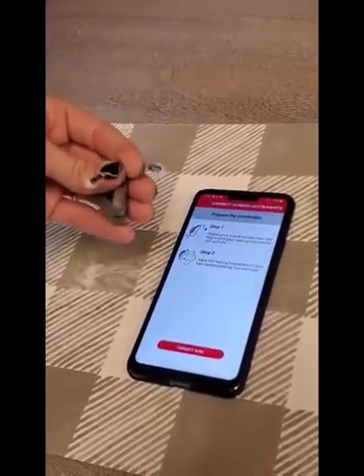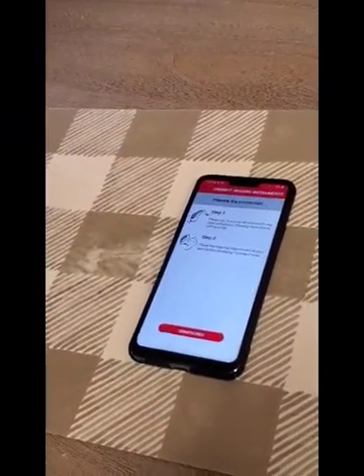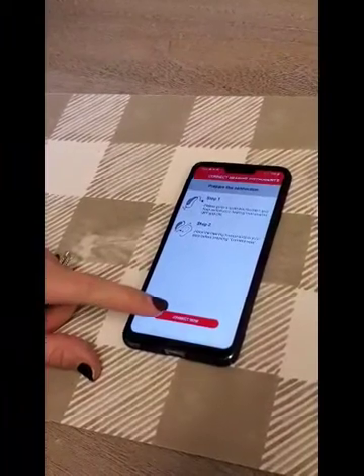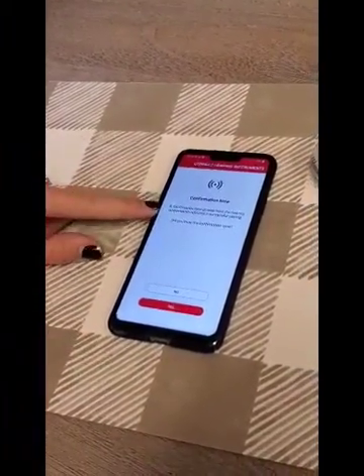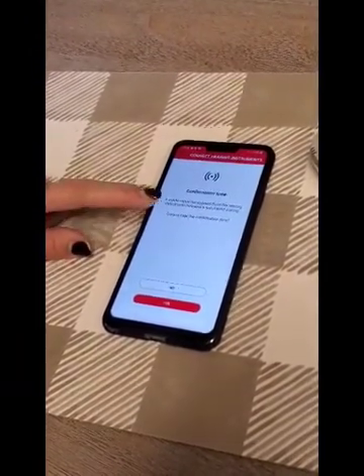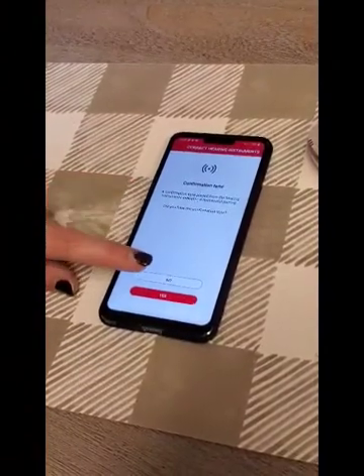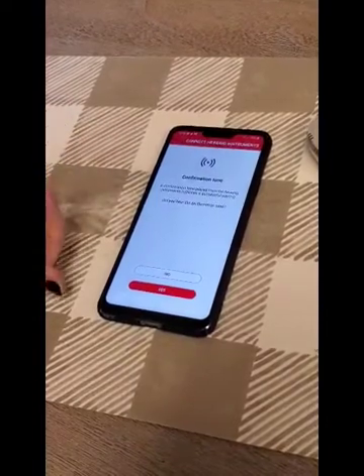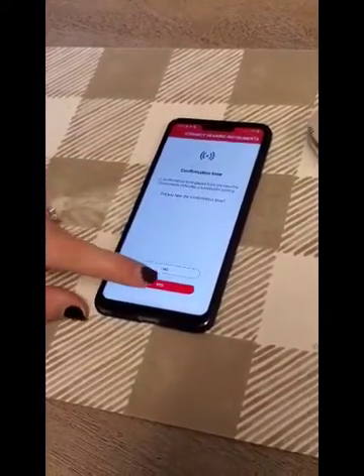Now you can go ahead and put the hearing aids back in your ears. After you get them in your ears, you're going to go ahead and hit Connect Now. You're going to listen for a confirmation tone played into both hearing aids. If you heard the confirmation tone, hit Yes. If you didn't, hit No and restart the hearing aids again to put them back into pairing mode. If you heard the confirmation tone, go ahead and hit Yes.